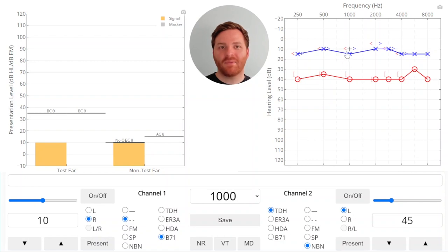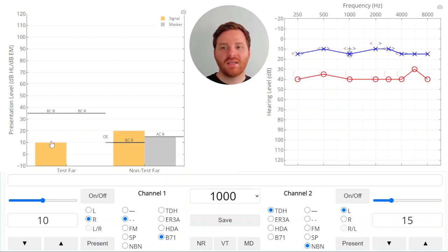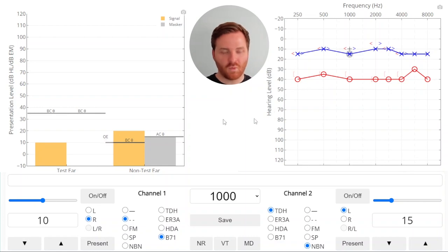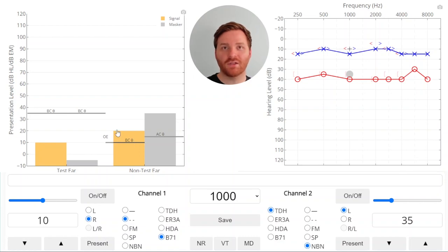They responded because the left ear, or the non-test ear cochlea, was sensitive enough to respond at that level. We notice that there's a significant air bone gap in the right ear, so we decide we need to mask. We turn on the masking in the non-test ear and put the transducer on that non-test ear, which covers it up. This creates an occlusion effect. At 1000 Hz, a 10 dB bone conduction sound in an occluded ear gets a 10 dB occlusion effect boost that we need to account for. So we're going to raise our masker level by 10 dB to cover up that occlusion effect, and then add our 10 dB safety pad. This ensures that we have enough masking in the non-test ear to completely cover up the crossed-over bone conduction signal, factoring in the occlusion effect.